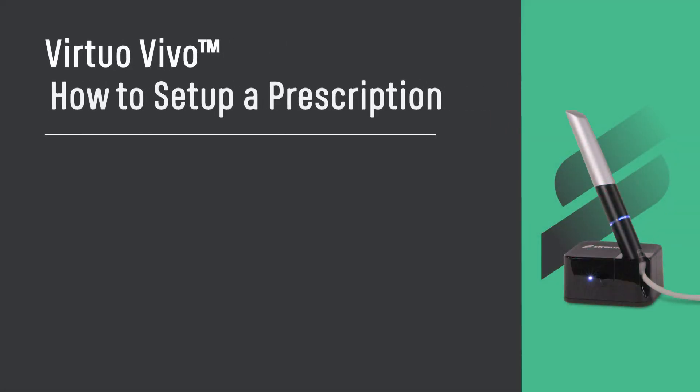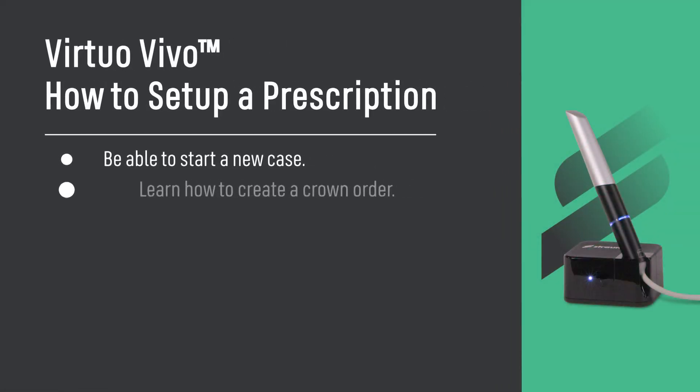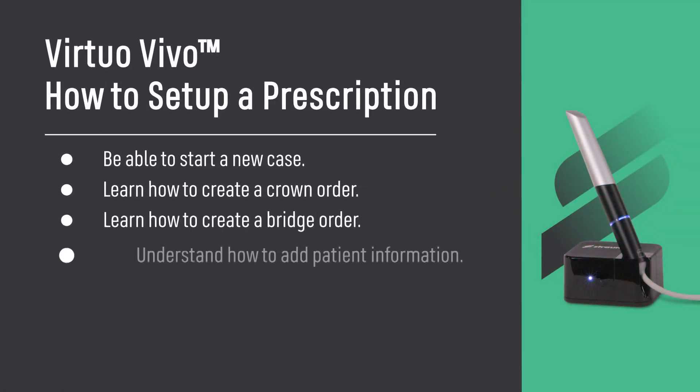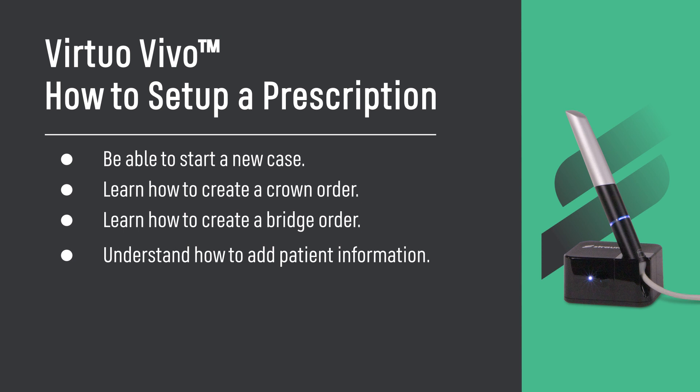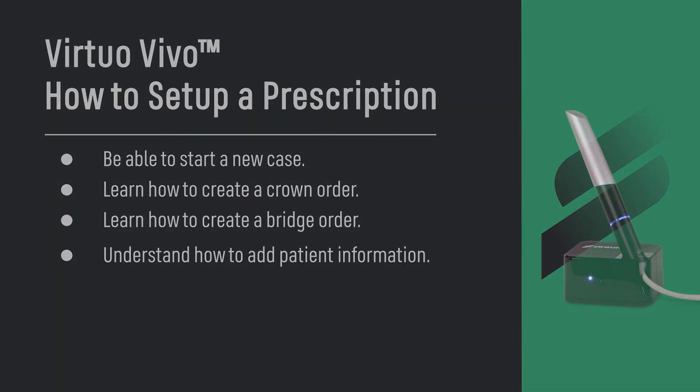Virtuo Vivo: How to Set Up a Prescription. Be able to start a new case, learn how to create a crown order, learn how to create a bridge order, and understand how to add patient information.